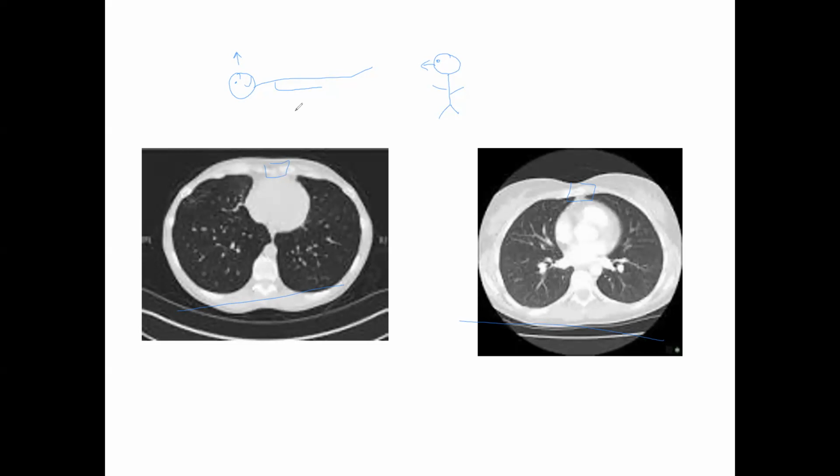So basically what happens with the CT is you look at these X-ray views. When you look at a chest X-ray, it kind of looks at the whole thing, but if you see something that looks suspicious on a chest X-ray, they might decide to order a CT scan, and the CT scan basically takes that patient and slices their body up via images.